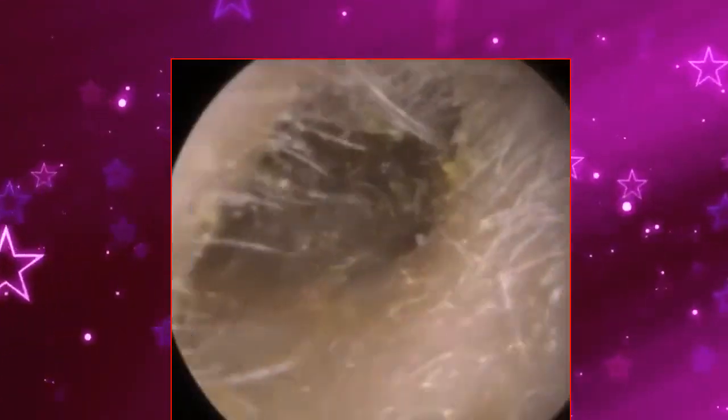Keratosis obturans is a buildup of dead skin that's shed from the ear canal but not migrated out. Our eardrum is made up of 3 membranes. The lateral layer, the one that's facing us, is made up of the same epithelial skin that lines the ear canal.